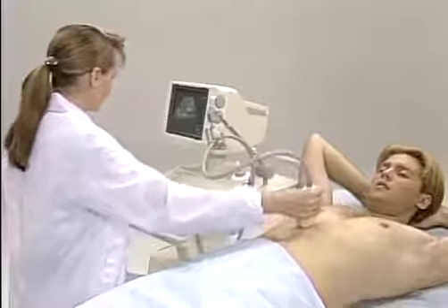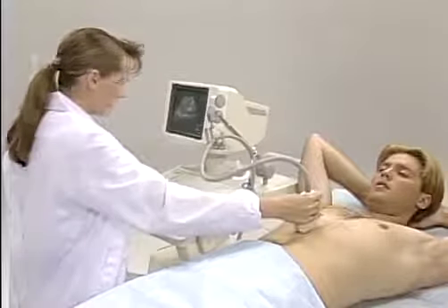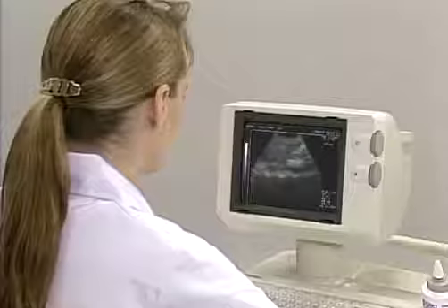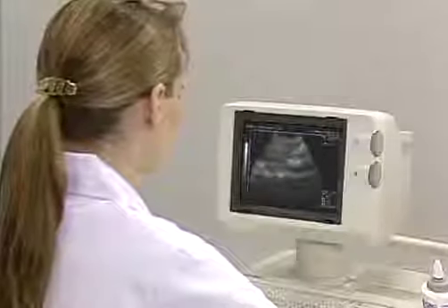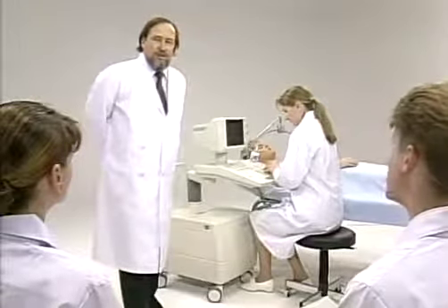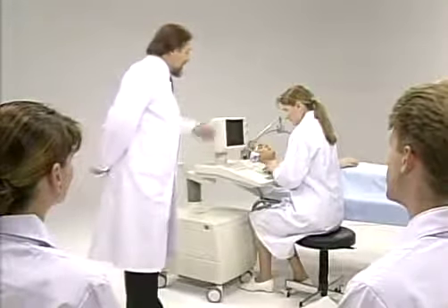When you want to obtain a clearer image, have the patient do abdominal breathing and have him breathe in and then hold his breath. Now, shall we discuss images obtained with the probe at this position?